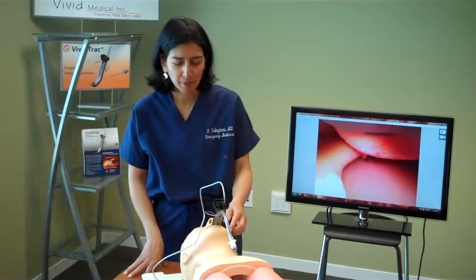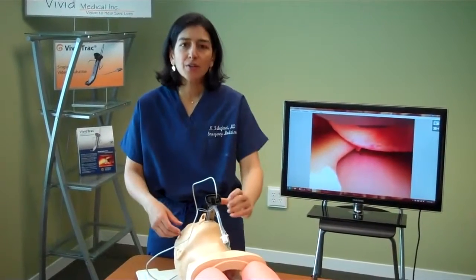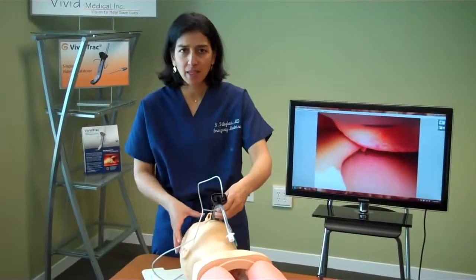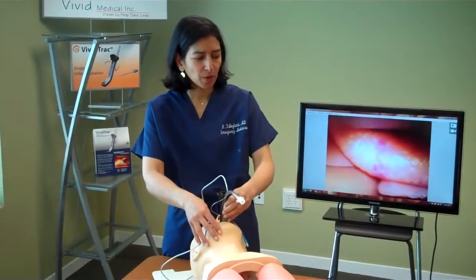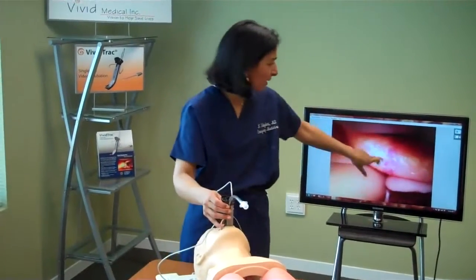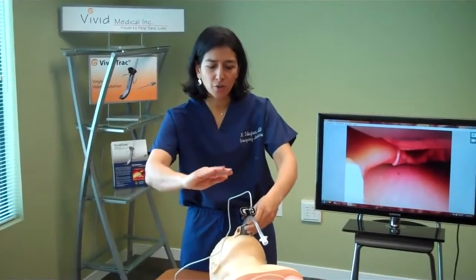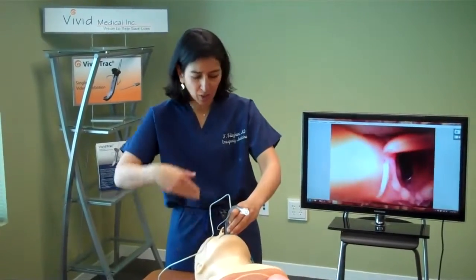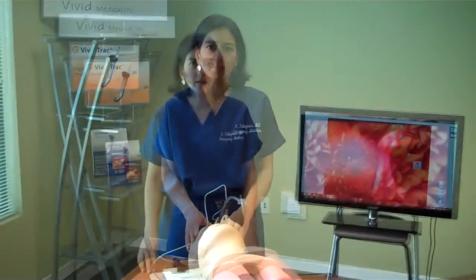A common mistake some people make is that they're so used to intubating with a laryngoscope that they turn the device too quickly, and it can sometimes get lodged in the tongue. For example, if you take the device and turn it as you would a regular laryngoscope, you can see on the screen how your tongue gets in the way. What you want to do is just follow the gentle curvature of the device. Just allow it to push in a little bit deeper, and the vocal cords will come immediately into your view.